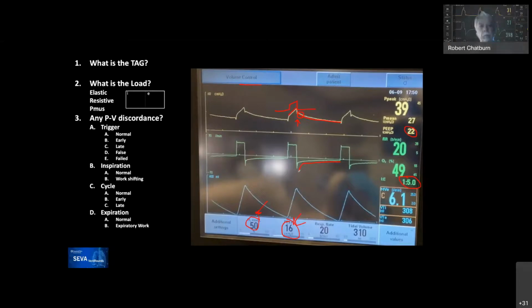All right, so we'll move on to the next one. The next comment was interesting: the inhaled and exhaled tidal volumes match. Yeah, I think a lot of the air was getting back out. It was just slowly, inefficiently, and we were probably still missing some of the trapping there. Yeah, if there's no leak, the inhaled has to match the exhaled, or the patient will blow up.